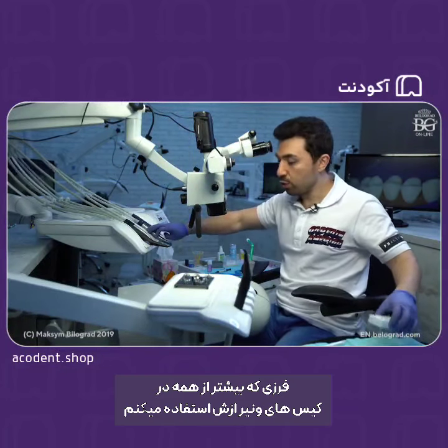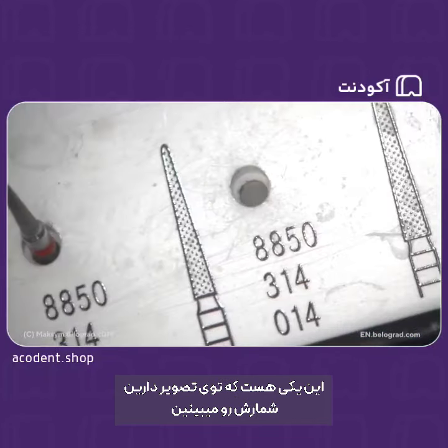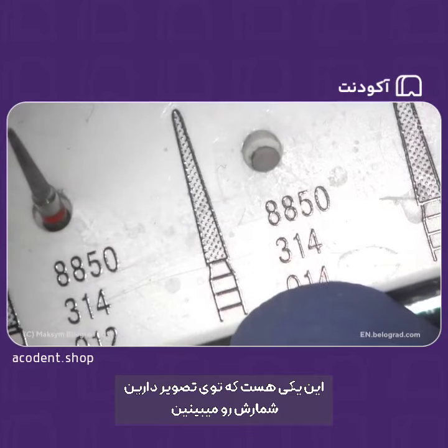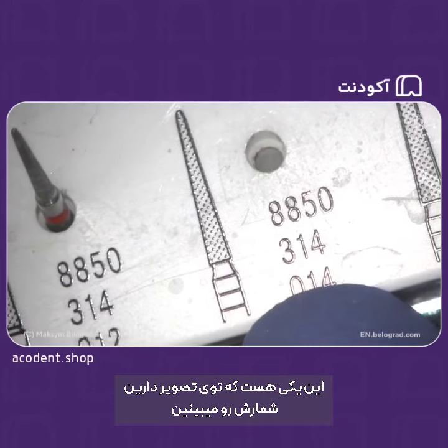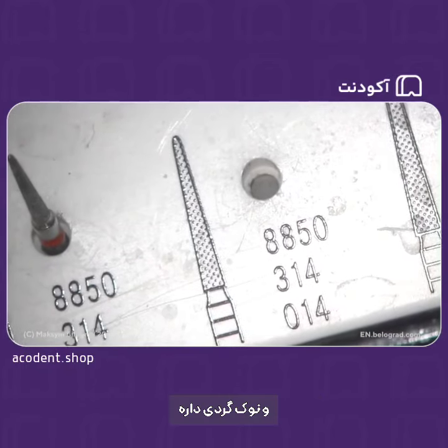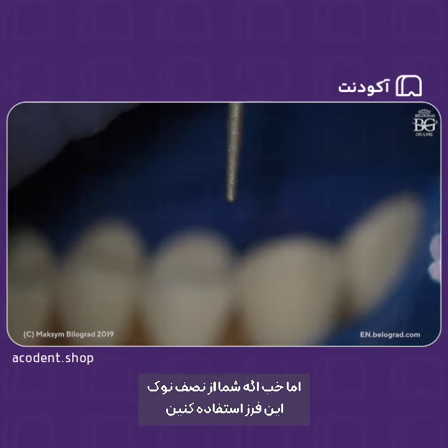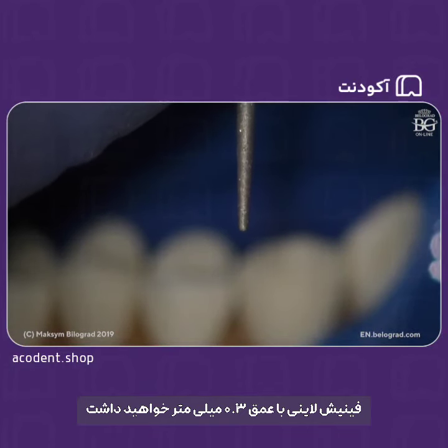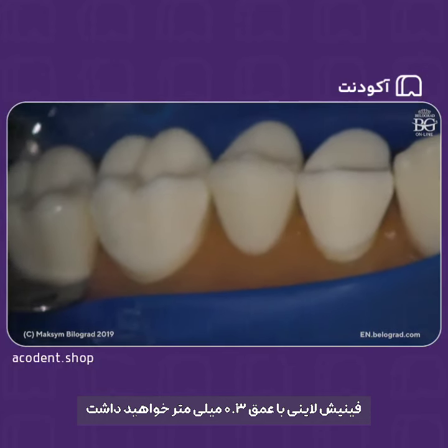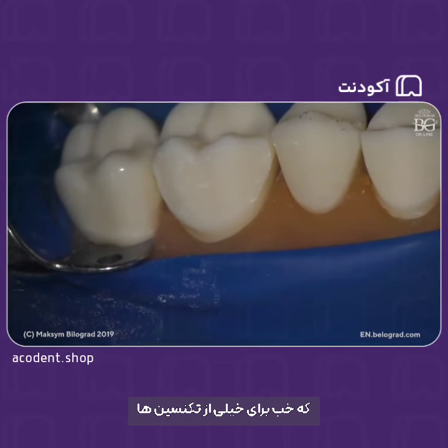The most frequently used one that I work with a lot in my veneer cases is this one. You can see this red diamond. The tip of this burr is 0.6 millimeters. The tip is rounded, so we have to use half or less than half of the tip. But basically, if you use half of the tip of this burr, you'll have a 0.3 finish line, which is good for many dental technicians and for many ceramic restorations.